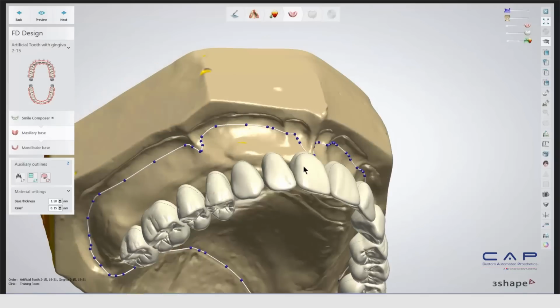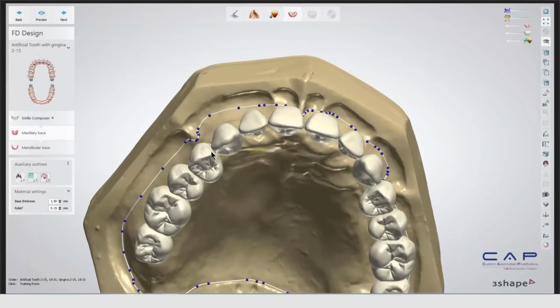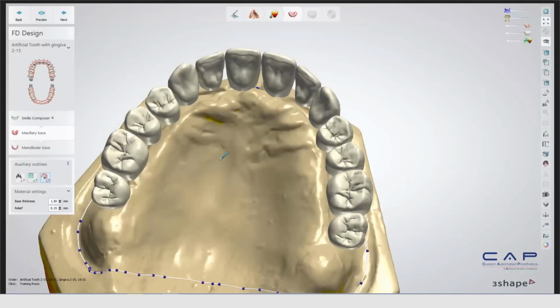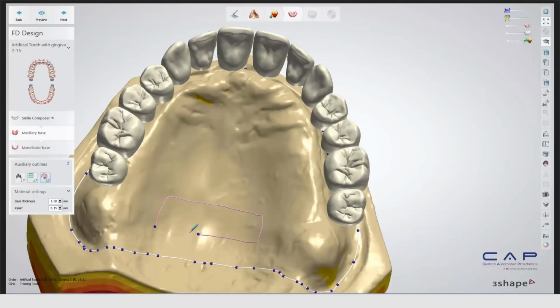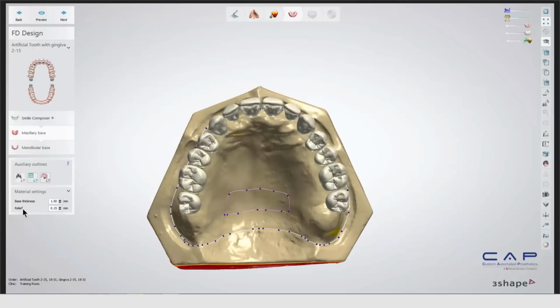base design. So the base design, again, allows us to edit this spline if we want to. And here we have additional options which allow us to give a window to the base if you wanted to give a little bit of a window onto the roof of the mouth here, or if you wanted to add extra relief zones. So if you wanted to add a suction area, you can go ahead and add a suction area at this back portion here to allow for extra grip. So you can add a relief zone on these areas. The added relief is just a typical 0.15, and this is just going to add that a little bit more to that area.